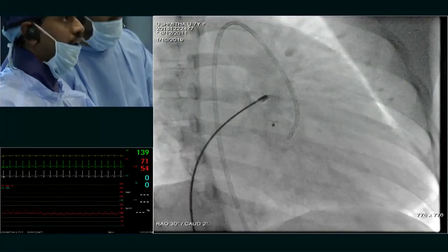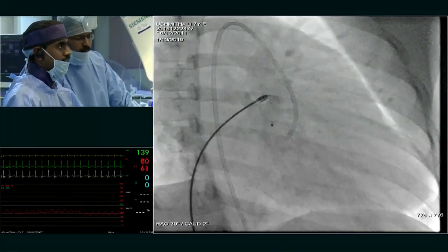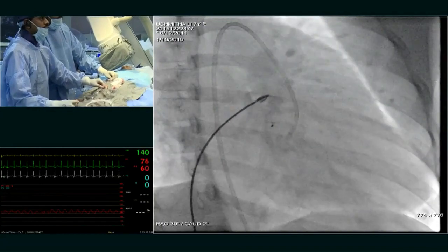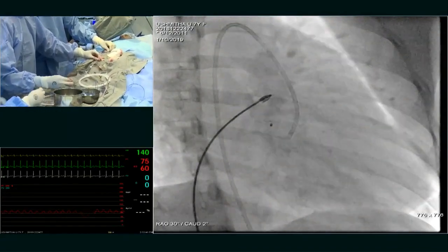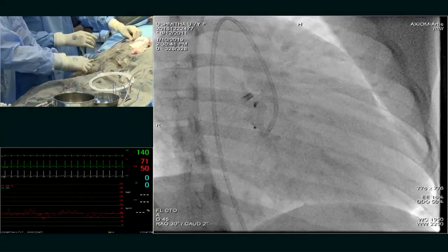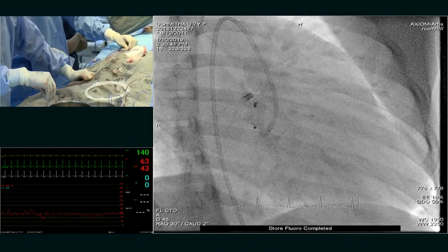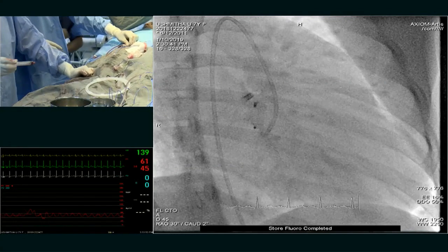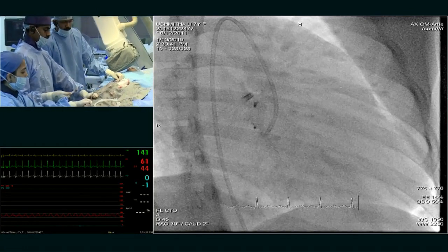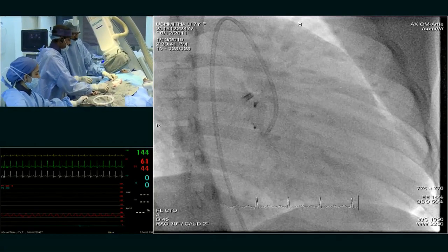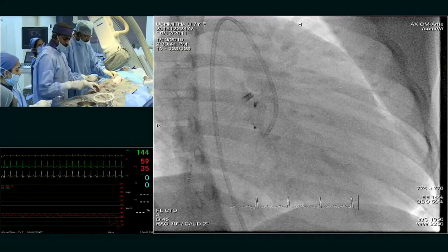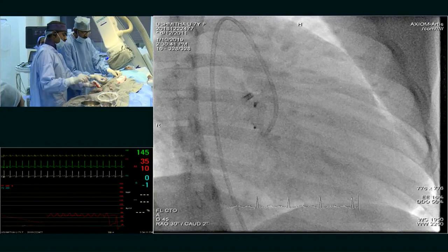I am using artery forceps. The screw came out. I have released it now. Can I get some more contrast? That is the exit point. The exit point will be closed with an ADO — a Lifetech PDA device. I will show now.